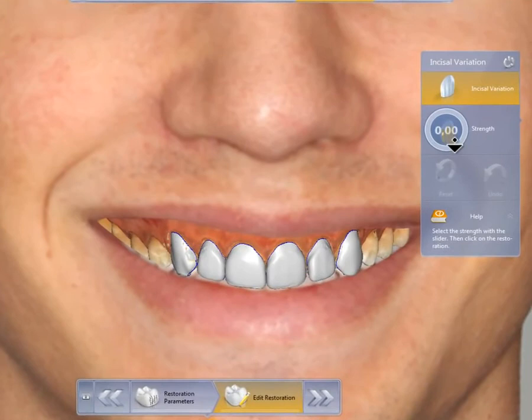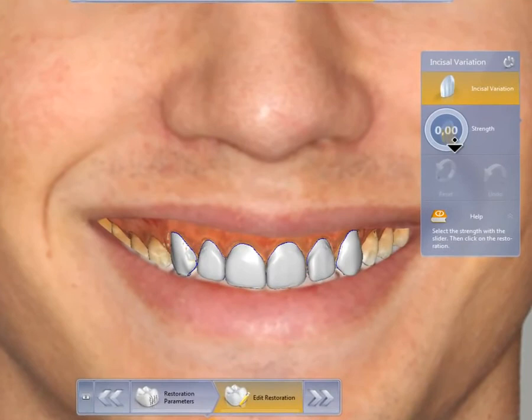The incisal variation tool, for example, lets us visually see the cutback technique in the front on all of the teeth at the same time.